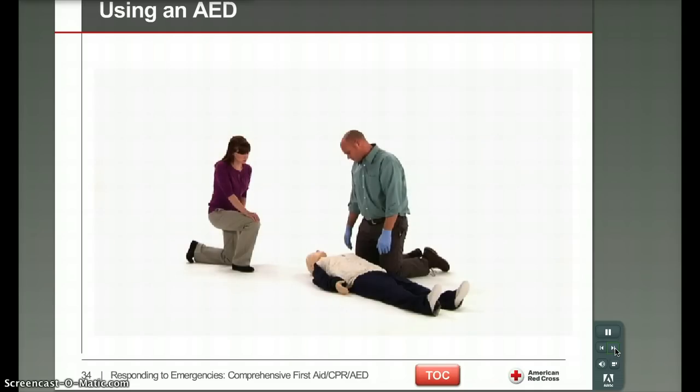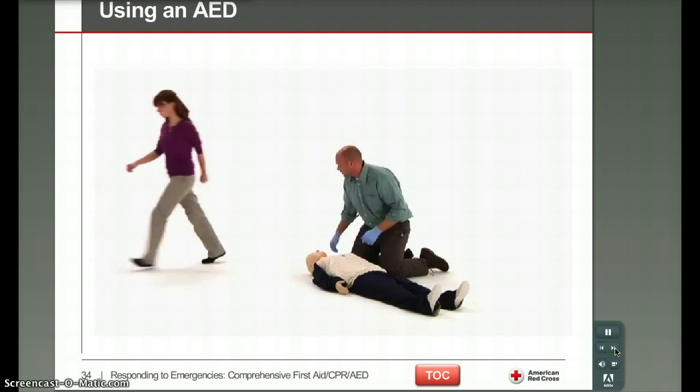Every year, thousands of people die of sudden cardiac arrest. She's unconscious. Go to the front desk, call 911, and bring me the AED.